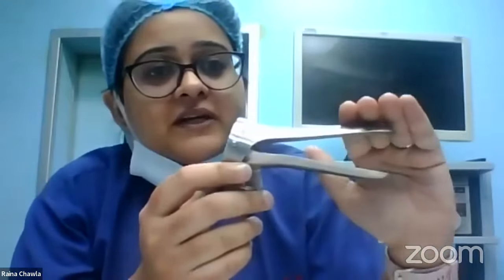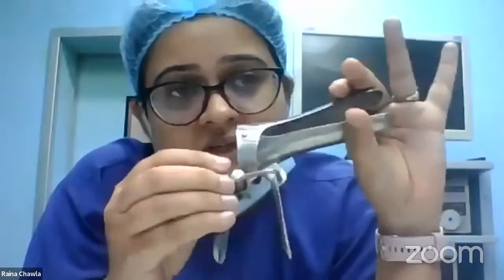Another disadvantage is it limits your view of the vagina because it occupies the anterior wall. So now your view is limited. So if there is an anterior vaginal wall cyst, Gardner's cysts are anterior vaginal wall cysts, if there is a vaginal cyst, you will miss it. So that is the disadvantage of a Cusco.